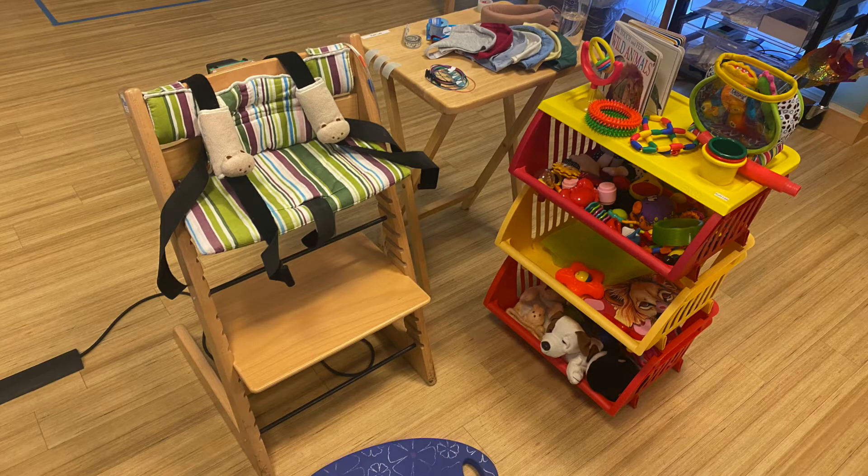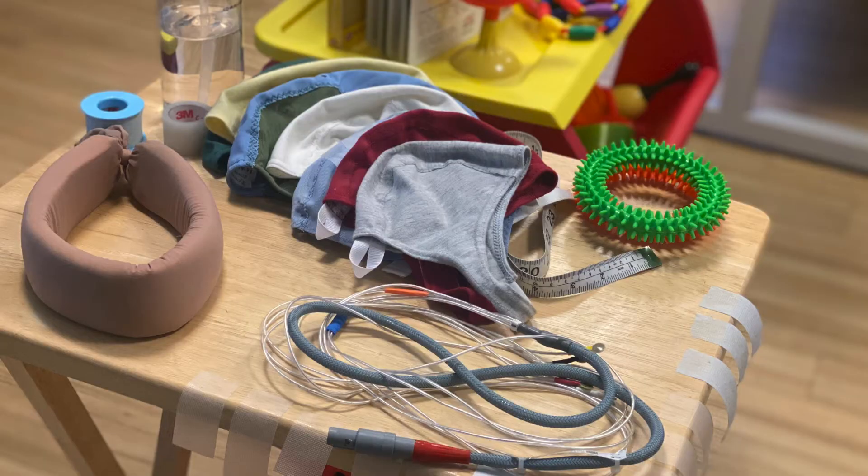To prepare for the family's arrival, we set up everything ahead of time. Efficiency is critical when working with infants. The preparation area is set up with a high chair and MEG-compatible toys. Here we see the essential items laid out in a way that makes them easily accessible to the technician during the appointment. Items include infant caps in a variety of sizes, HPI coils, electrodes, tape, and a foam ring that is used to protect the baby's head.